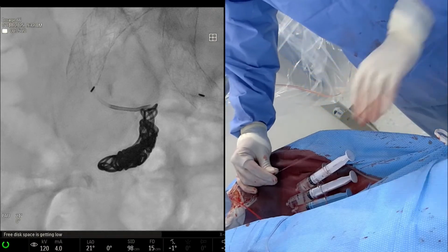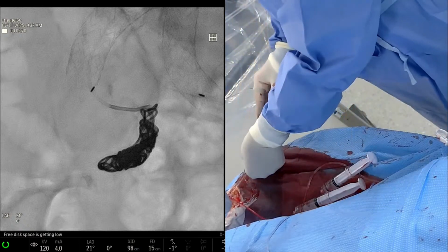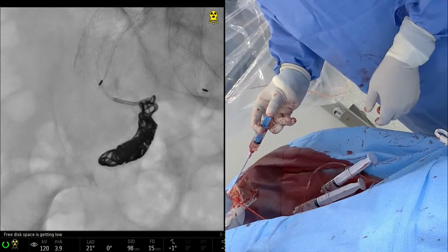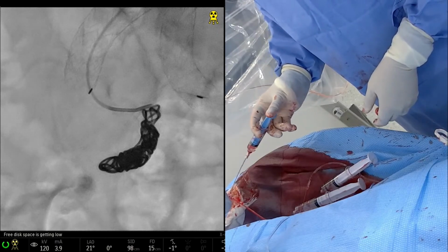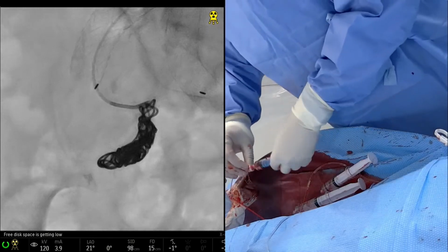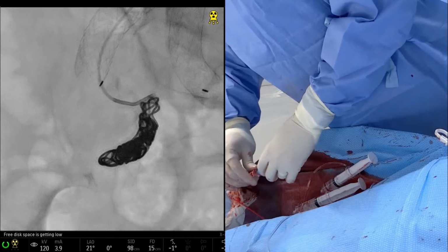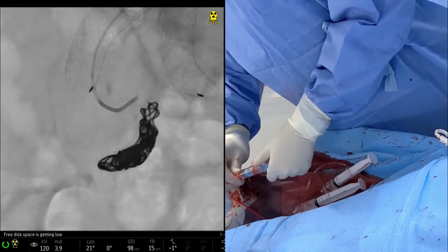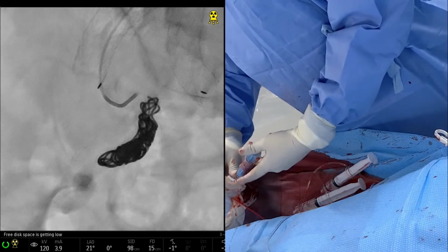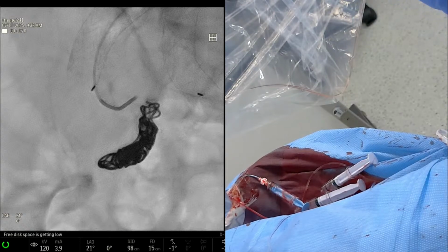So most of these, it's not as critical to go for a full complete occlusion. You can get burned occasionally where you have retrograde fill, but I think in a non-aneurysmal internal iliac, you're probably fine. And then you're going to cover it so you'll have no inflow into it, and hopefully that will thrombose. One thing that I do watch out for is sometimes a proximal branch, like an iliolumbar, may come off the proximal internal iliac before the divisions. So I always look for that.